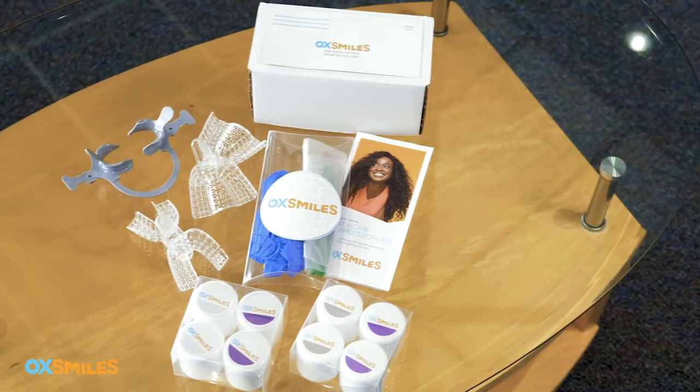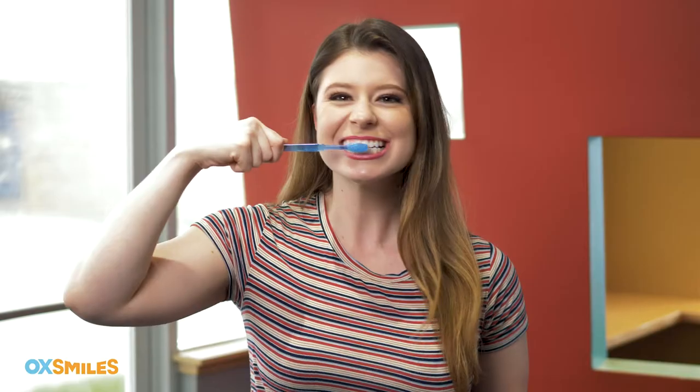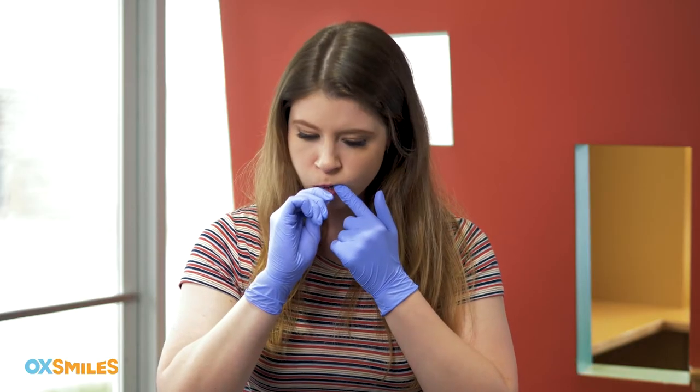Once you decide it's impression time, these are the steps to follow. Step one: prepare everything you need by laying out all the items from the box. Step two: brush and floss your teeth, wash and thoroughly dry your hands, then put your gloves on — be sure your hands are completely dry so they slide on smoothly. Try on the trays to check how they fit; there should be some space around your teeth.